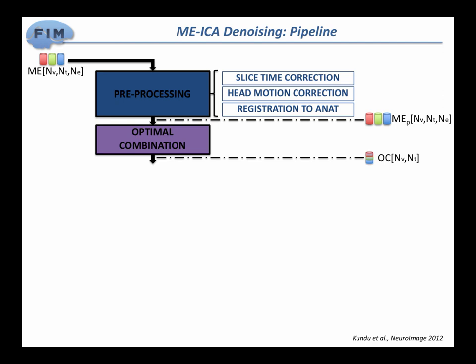Yeah, go ahead. Just say it loud. So what are the sources of the S0 changes? So you have inflow effects, you have hardware instabilities, things like that. In general, everything that you wouldn't want in your data. How about the changes due to the respiration?